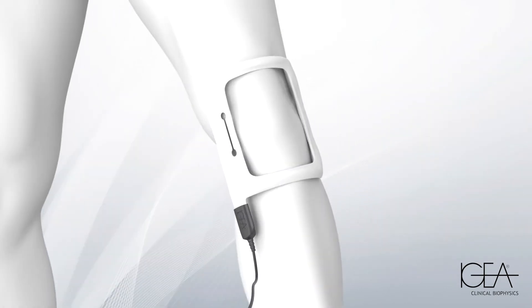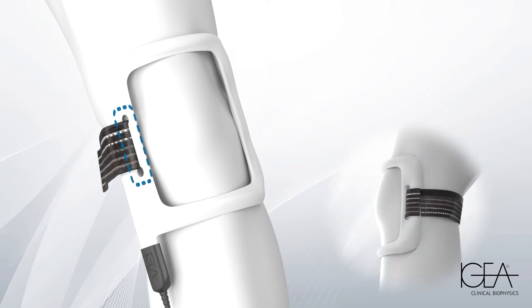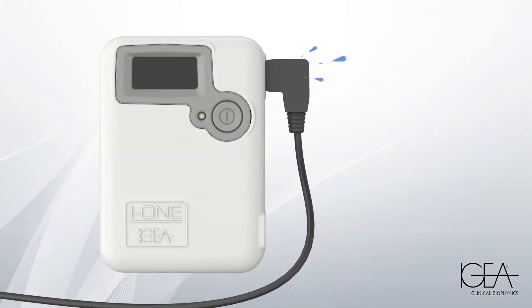Position the coil on the area to be treated and secure it with the supplied band without over-tightening. Connect the coil to the right socket of the generator. You will hear a click when they are properly joined.